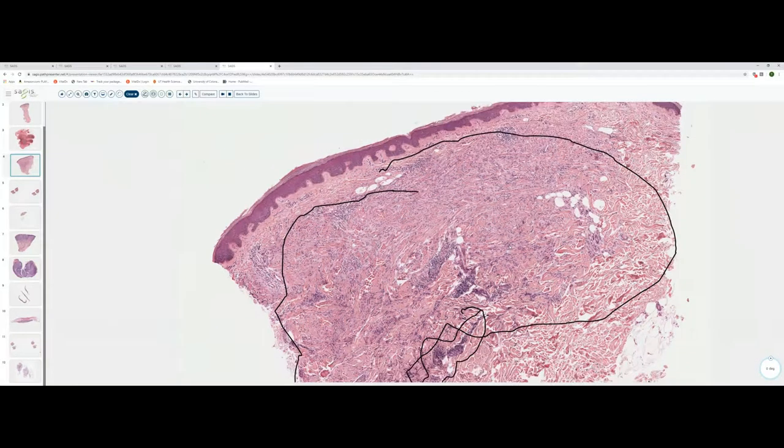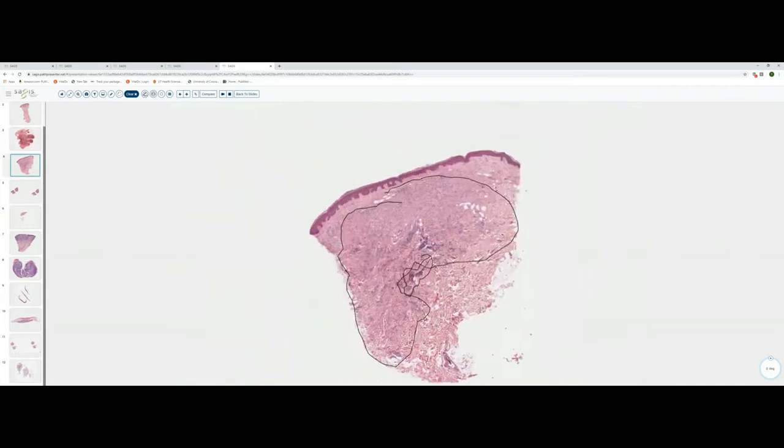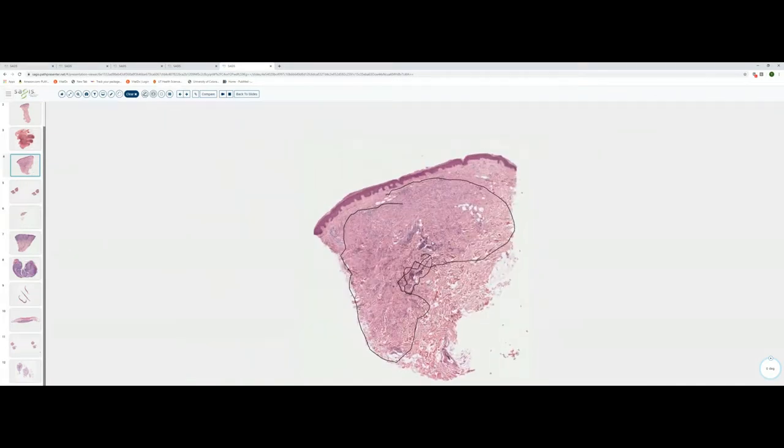GA doesn't scar, unlike necrobiosis lipoidica. So the collagen bundles in GA are not really degenerated, they're just separated from one another by mucin. So this is a pretty classic example of GA. GA is in that group of disorders that gives you a busy dermis look, kind of a hypercellular dermis. And on scan, when you see that appearance where it looks like there are a lot of cells present interstitially within the dermis, you need to think about GA. You should think about a blue nevus. You should think about Kaposi sarcoma. You should think about metastatic carcinoma.